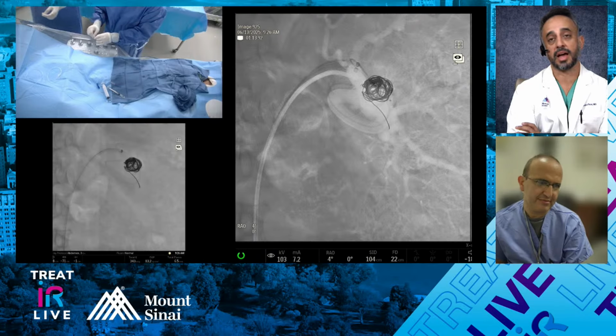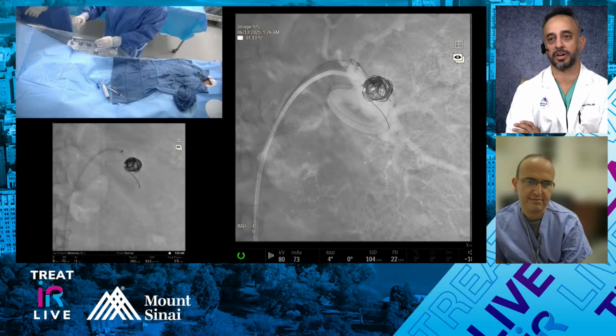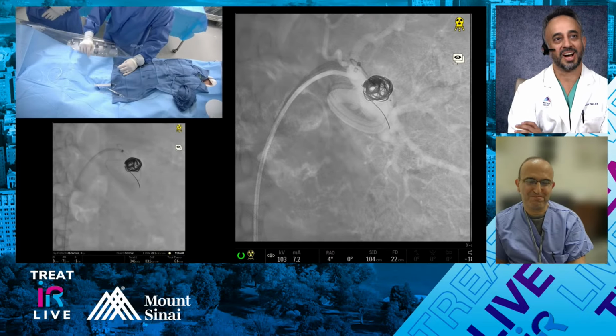Rahul, you can take that question. Yeah, I mean, I've done that in trauma cases where I've coiled a splenic artery and it's just not shutting down fast enough. Part of that is my own impatience, just not wanting to wait.